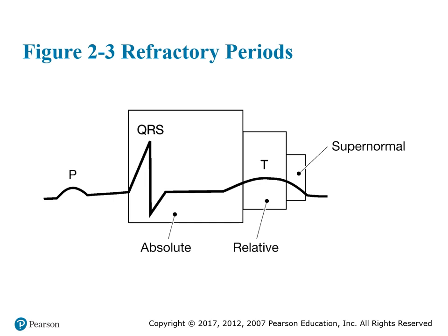During your relative refractory period, if your T wave is starting to form, yet another impulse can come in and form another PQRST wave. It's basically what it's saying. It can form another PQRST wave.